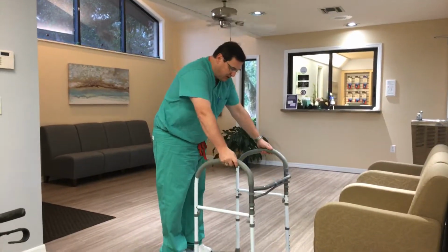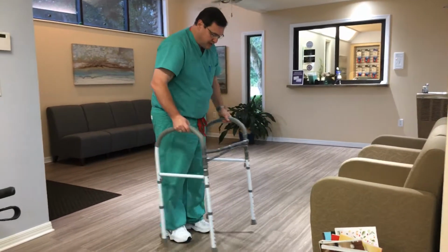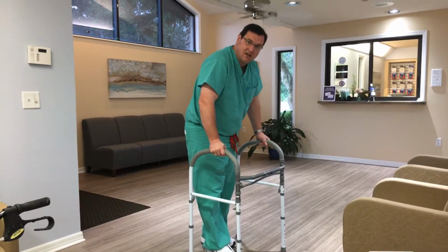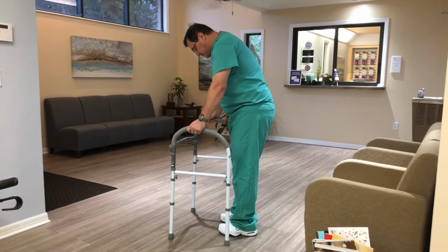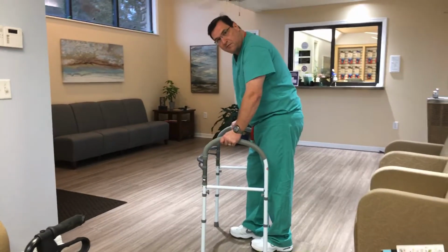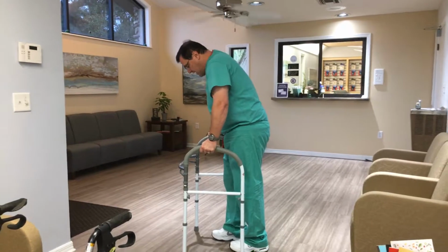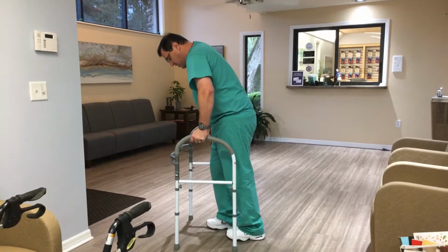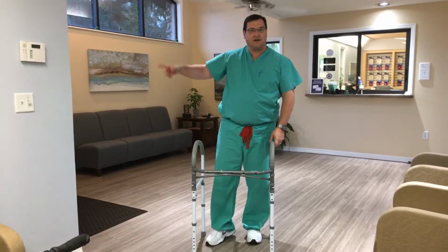The problem is if you bring it way out, the bigger the step, the more weight on the foot. And if you're trying to be non-weight bearing, it really needs to just be half a step, just your foot halfway past the other one, weight on the arms, foot comes up. So going this way to demonstrate half a step, you can see the shoe is just halfway past the other shoe, weight on the arm, foot comes up. Walker forward, half a step, weight on the arms, foot comes up. And it'll take forever to get from here to there, okay?